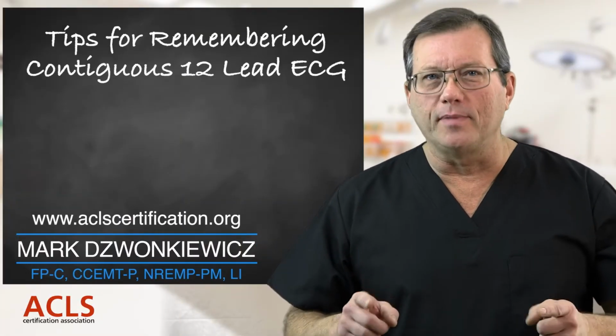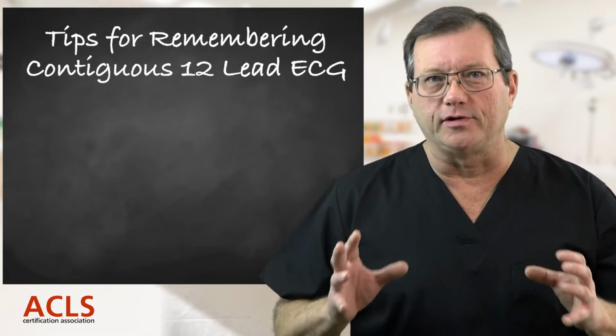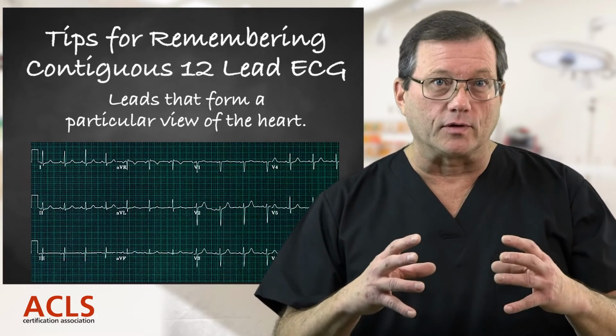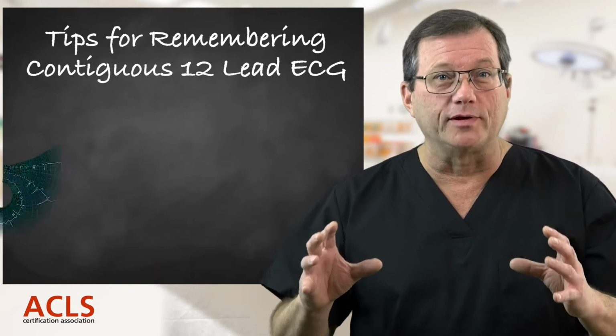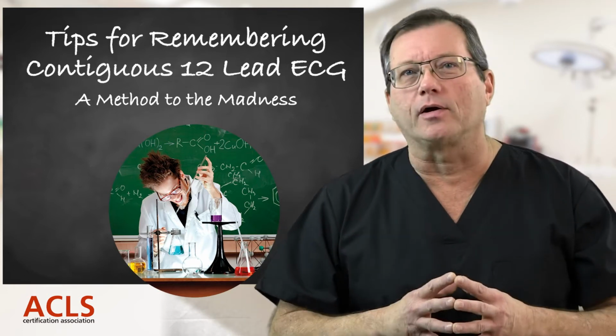Hi everyone, in this video I want to share with you my method for determining contiguous leads on a 12-lead ECG. Now remember, contiguous leads are leads that go together to form a particular view of the heart. But on a 12-lead they're kind of random and all over, so we need a method so we can remember which leads go together to look at a particular part of the heart.